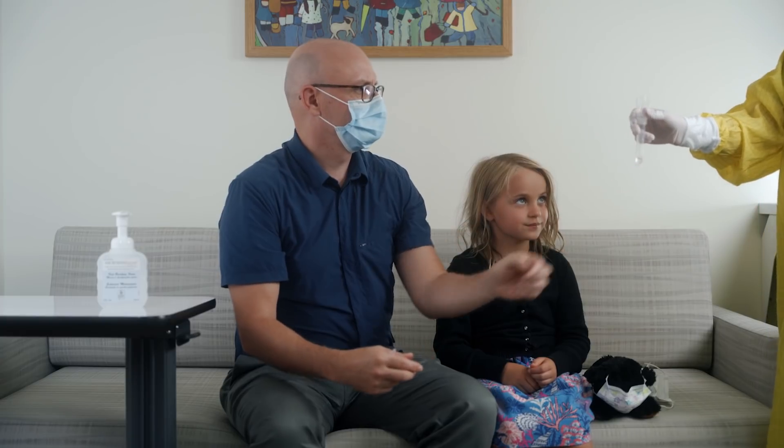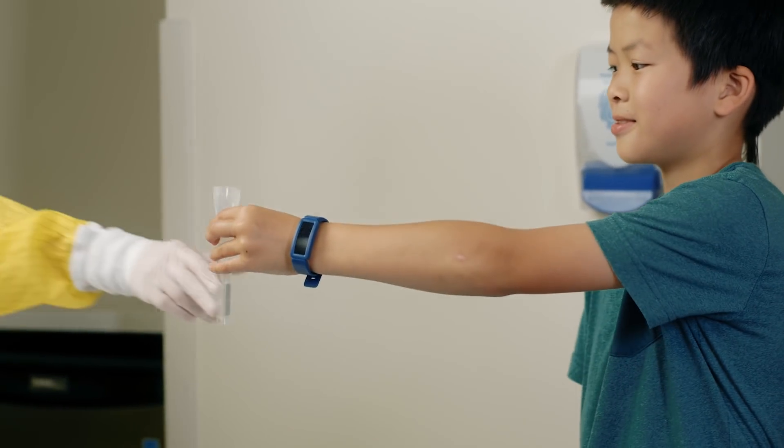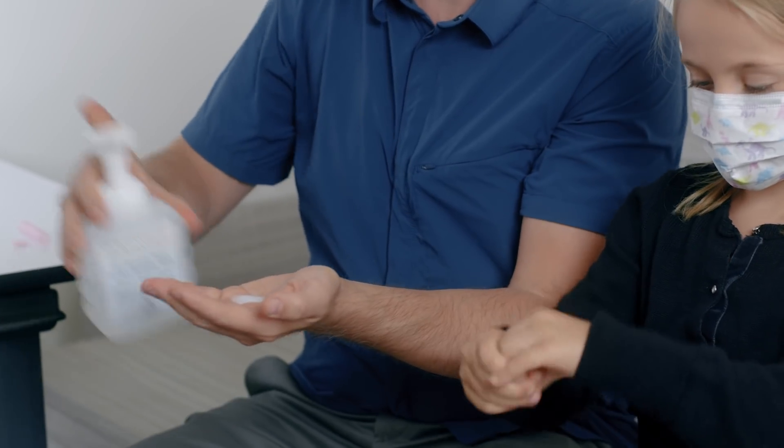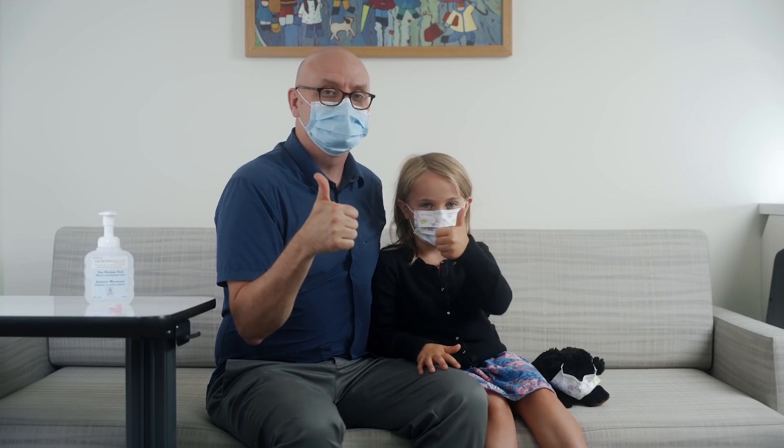Place the sample container on a flat surface as directed or hand it to the health care provider. Make sure you wash your hands. Remember, just because you had this test does not mean you have the virus. Thank you for coming in for the test. Now you're all done.